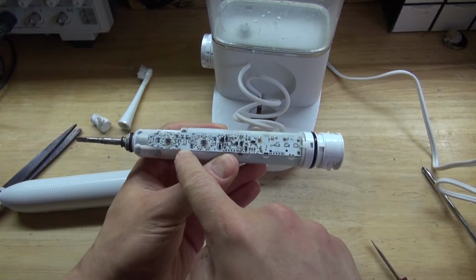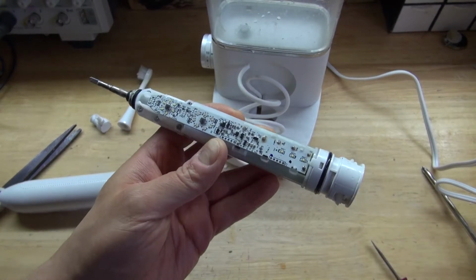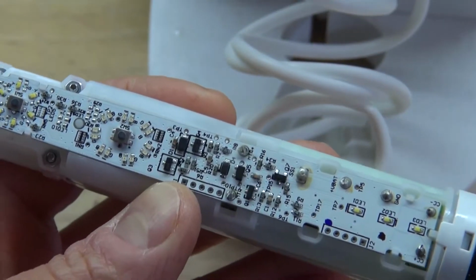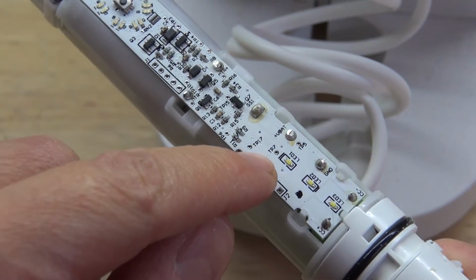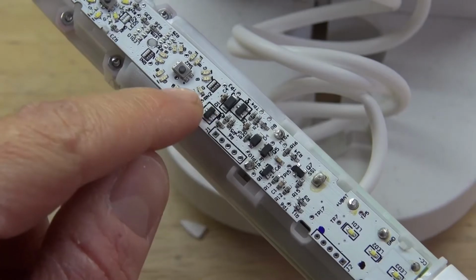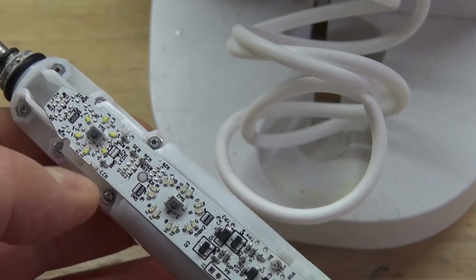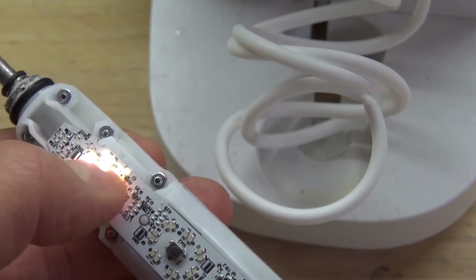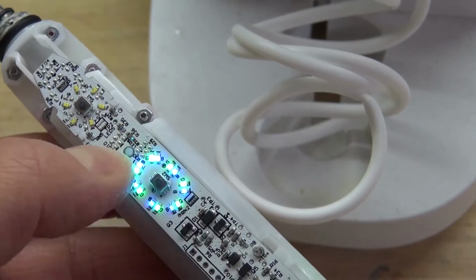And right here is the circuit. A very interesting, simple circuit. A bunch of surface mount components that are potentially useful, but I may not use actually. The LEDs, however, may be useful. And some of these little transistors, and more LEDs and push button switches, which I could possibly use for other projects. Pushing the button and you can see the LEDs light up, which means it still works.